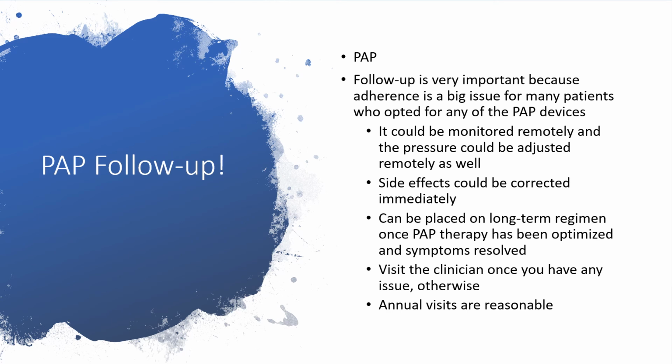PAP follow-up. Follow-up is very important because adherence is a big issue. For many patients who opted for any of the PAP devices, we have to follow up. It could be monitored remotely, and the pressure could be adjusted remotely as well.